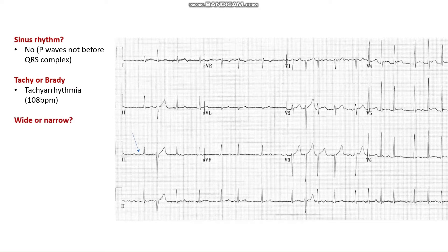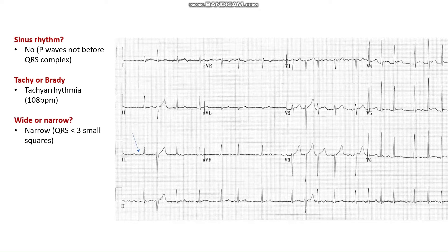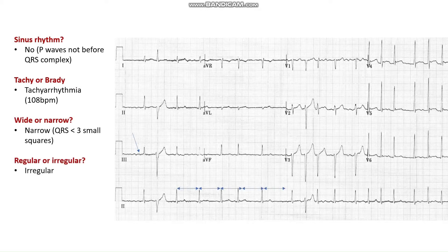The next question: is it a wide complex or narrow complex tachyarrhythmia? We can see that each QRS complex is less than three small squares, so this is a narrow complex tachycardia. Is it regular or irregular? This is clearly an irregular tachyarrhythmia — the distance between each QRS complex is not consistent. So to summarise: we have an irregular, narrow complex tachyarrhythmia with no discernible P-waves, which is classic for atrial fibrillation.